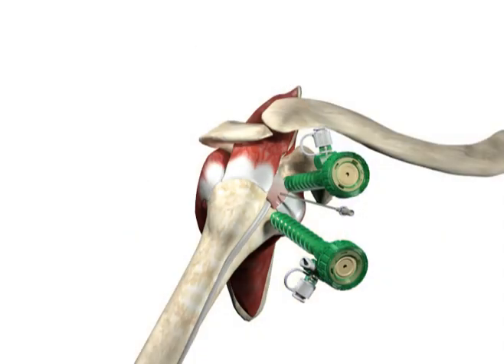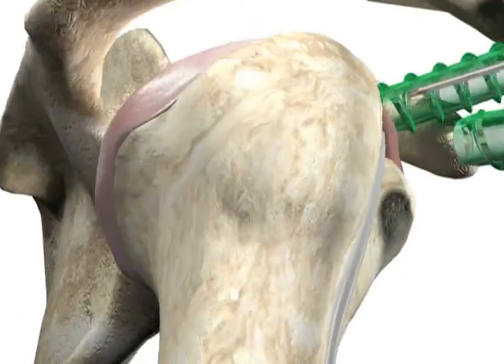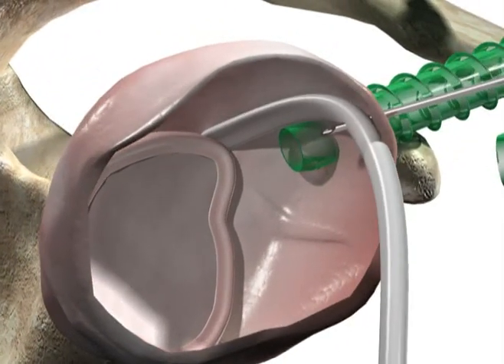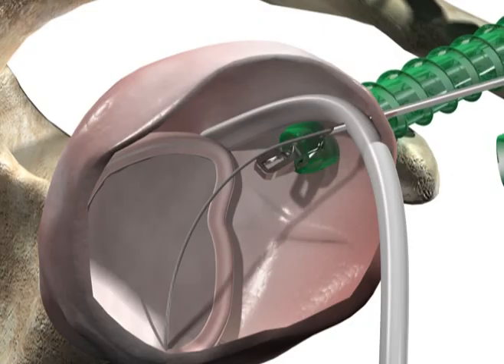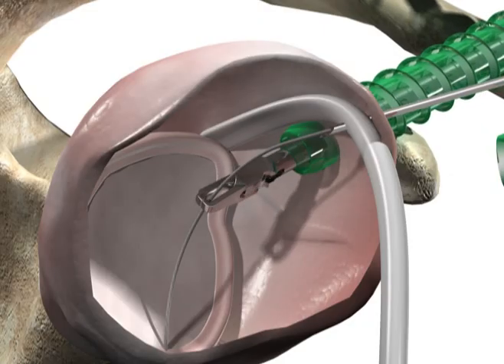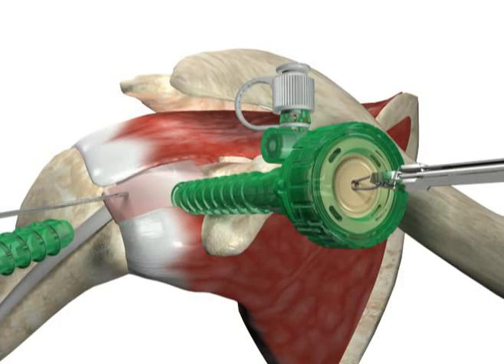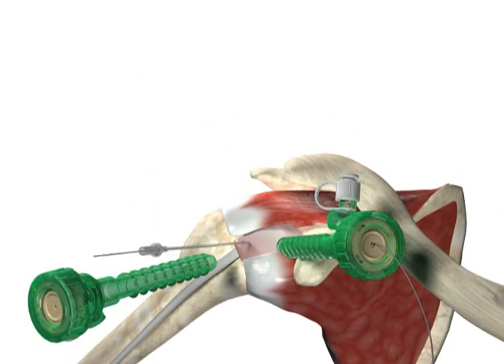Insert a spinal needle at the anterolateral edge of the acromion into the shoulder joint just anterior to the supraspinatus tendon and through the biceps. Introduce a monofilament suture through the needle and biceps tendon. Using a grasper, retrieve one limb of suture out the anterior interval portal. Remove the spinal needle.